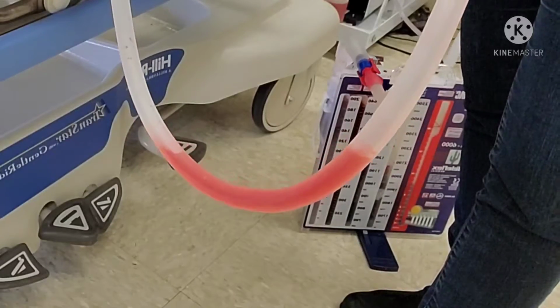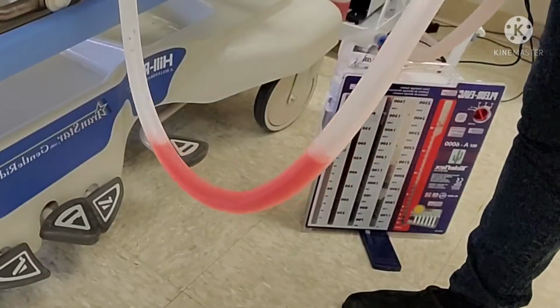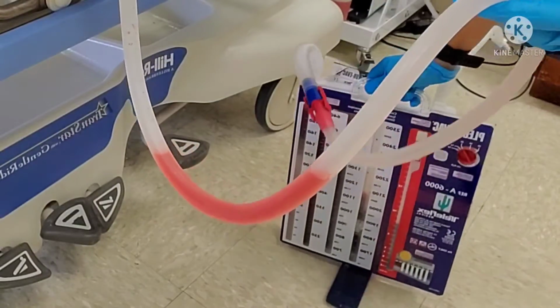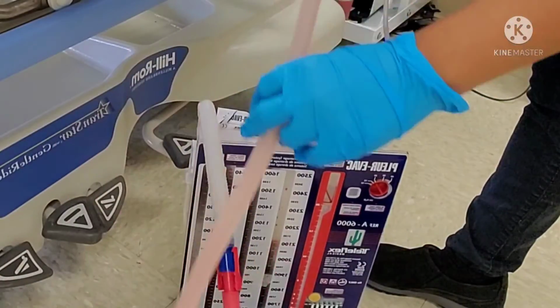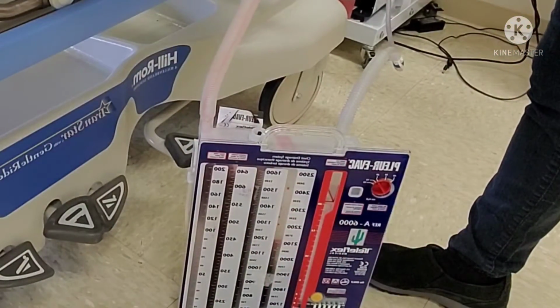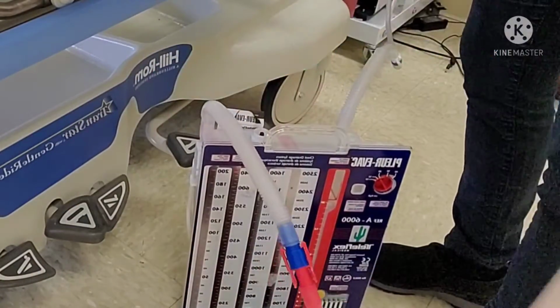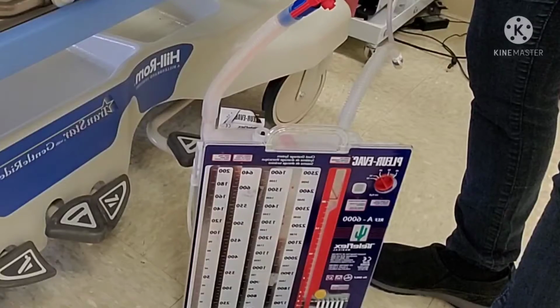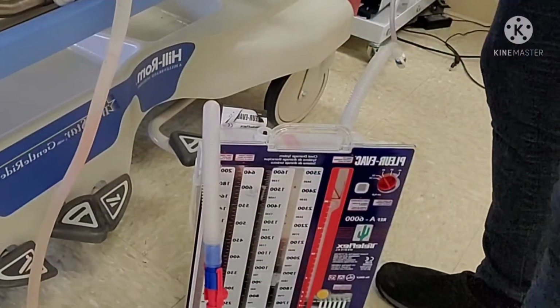So if my blood clots, is my chest tube going to function the way I want it to? No. So what I'm going to do, let me bring this closer so you can see. I'm going to basically help this blood drain into my Pleurovac, into my drainage system. So all I did was lift up the tube and drain it into my drainage system, okay? And we'll talk about that in a minute.